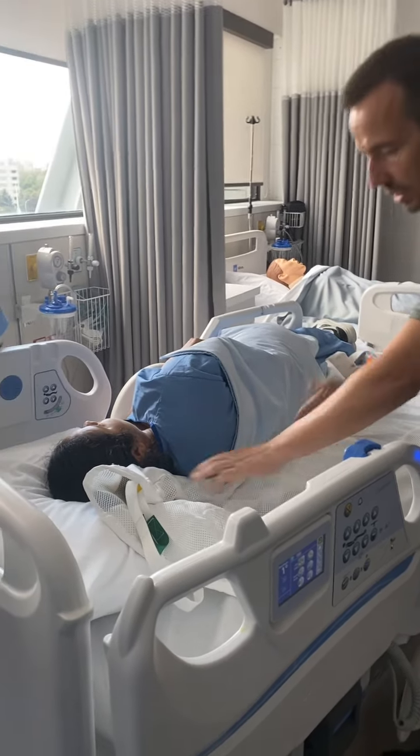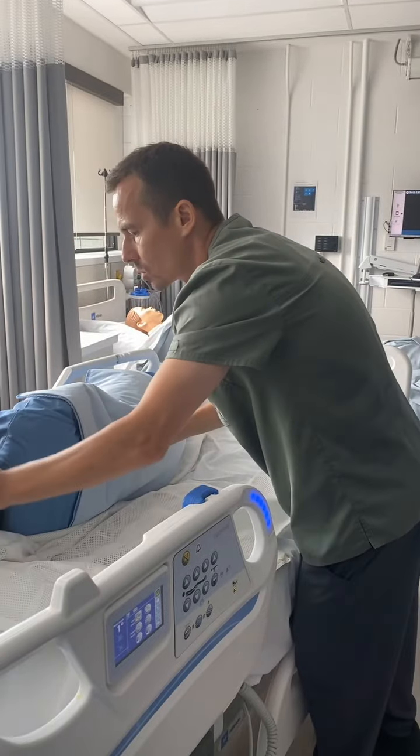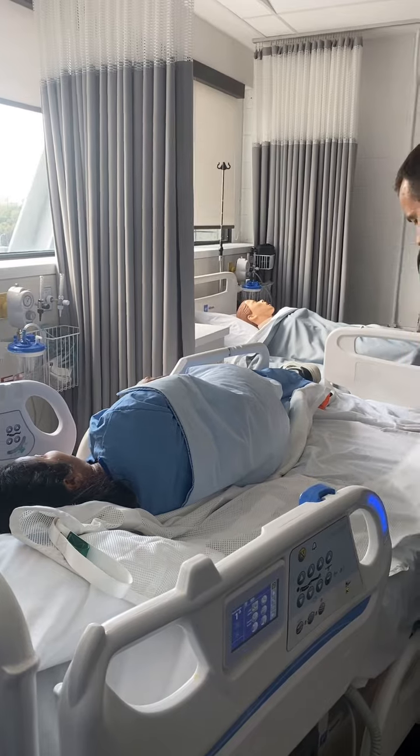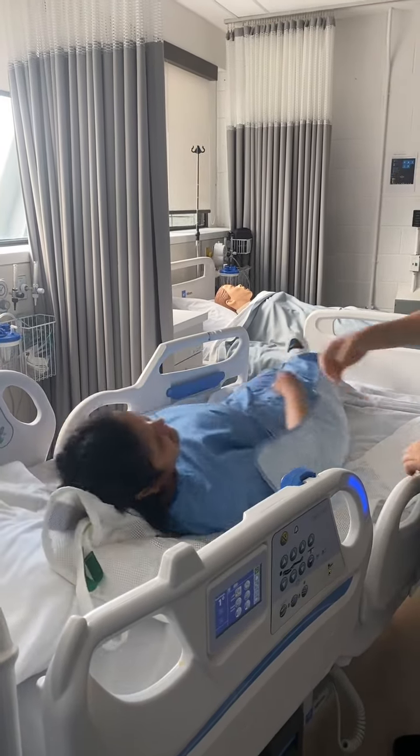But our patient, bed mobility is okay, they just can't weight bear. That's why we need this thing. Okay, so we align this thing. Good? You can turn. Turn towards me this time.